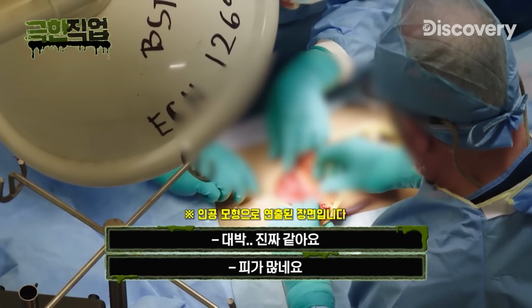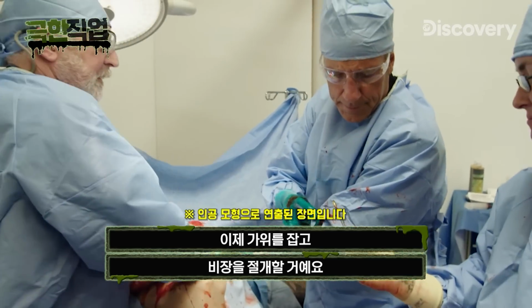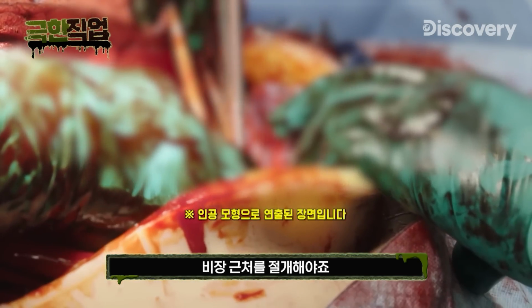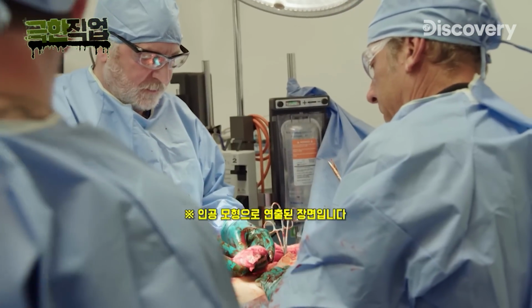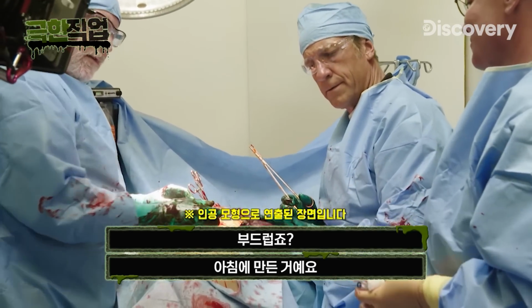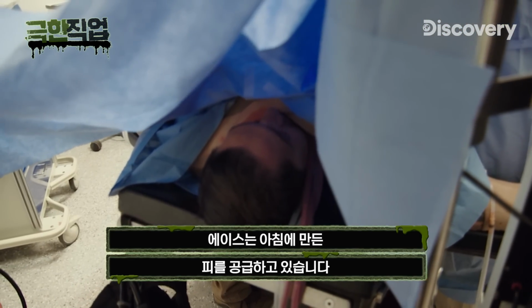Good grief, that's realistic. We got a lot of blood in there. So you're going to take some scissors, and you're going to start releasing the spleen. It's going to cut right there. As close to the clamp as I can. No, as close to the spleen as you can. So there's your, feel it, soft. I mean, you were making it this morning. Yeah. Aislinn is back there, pumping the fake blood we made earlier today, keeping it real.